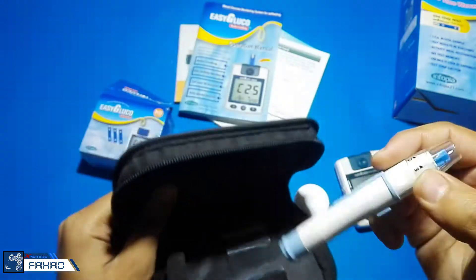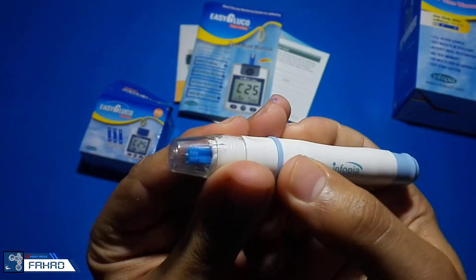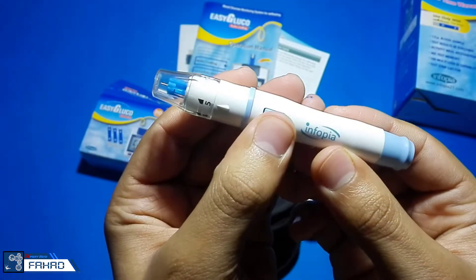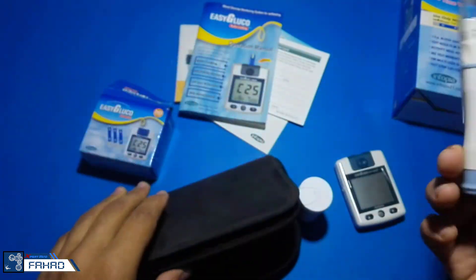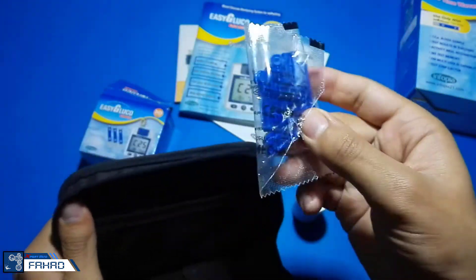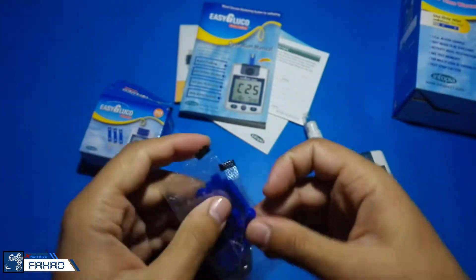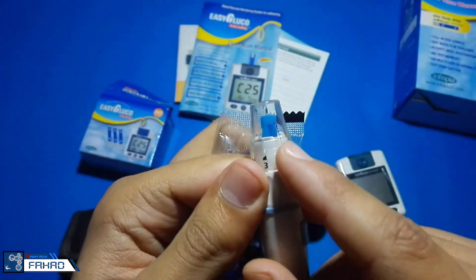This is the lancing device and it is used to take samples of blood. These are the lancets which are used in the lancing device to take blood samples from the human body. You can also increase the depth range from here.